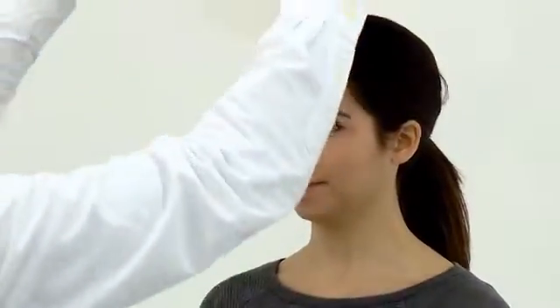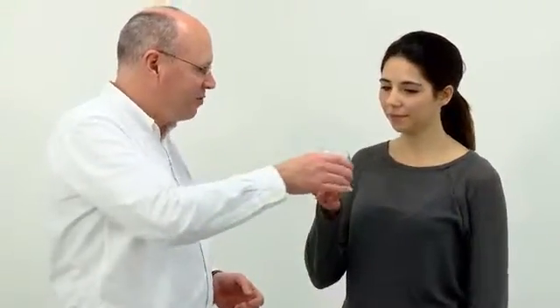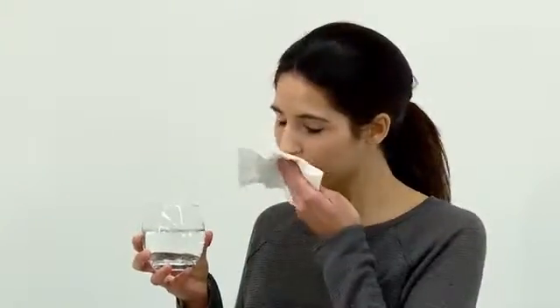Time should be allowed for the taste to clear from the wearer's mouth before starting the fit test. Rinsing with water may speed this up. The subject should also wipe their lips to remove any residual sensitivity solution. Explain the test and the 7 exercises to be performed. The exercises are designed to simulate some of the stresses the face seal experiences during the working day.